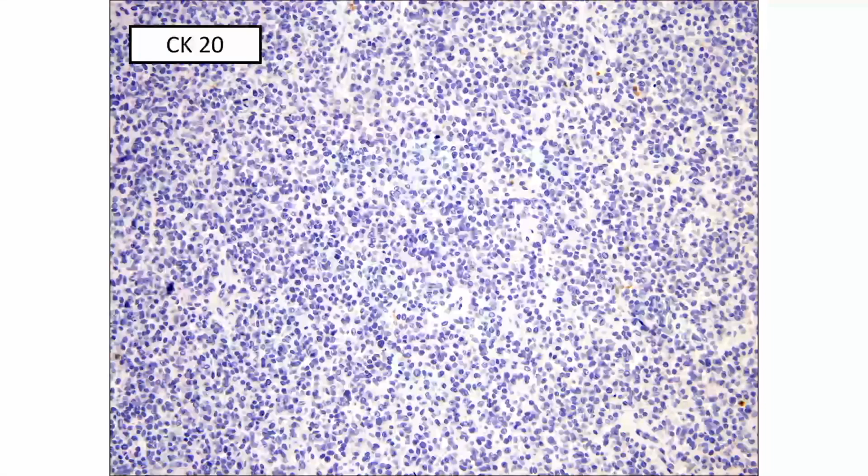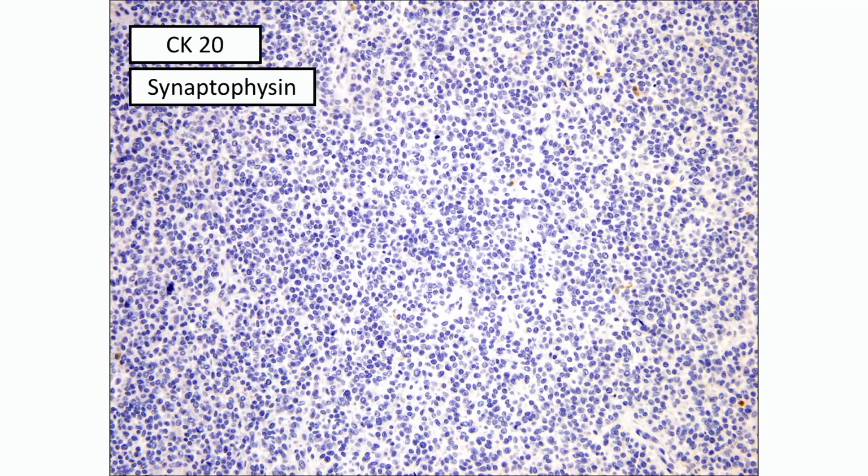All right, so I thought, well, maybe it's a Merkel cell carcinoma because it's an older woman. So I did CK20 and synaptophysin. They're negative. Okay, so it's not that. That's no problem. Okay, I know. Maybe it's some kind of adnexal tumor. Well, AE1/AE3 is negative. So now I'm starting to get a little nervous. And is it melanocytic? No, S100 is negative.